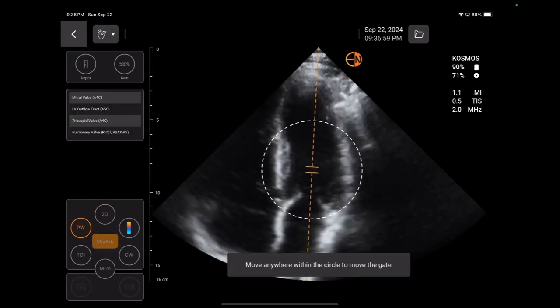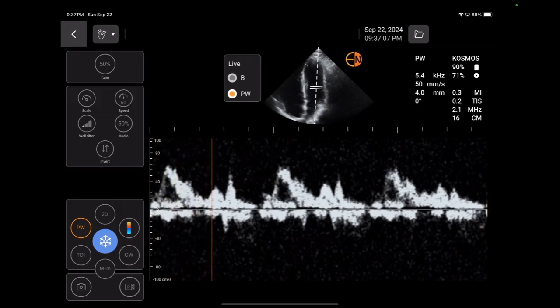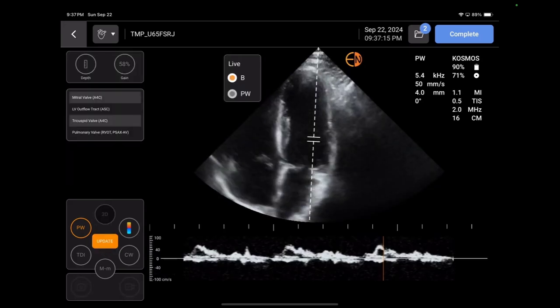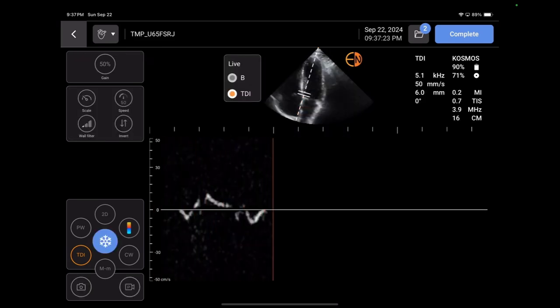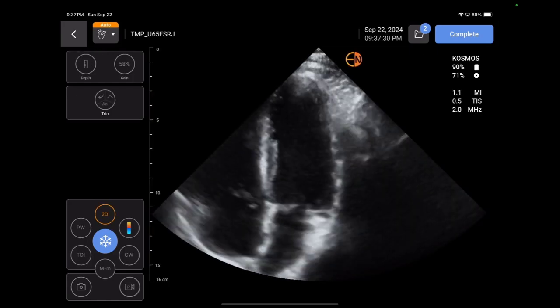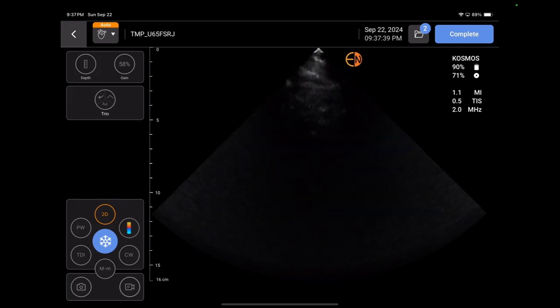For the pulse wave Doppler, if I was going to do a little diastology on myself, I press pulse wave update. I can freeze and save that image — you can see the E wave and the A wave really nicely. I can unfreeze and go back to 2D. If I'm going to do some tissue Doppler, I click the tissue Doppler button, move the gate to where it needs to be, press update, and get a really nice wave. What's really unique about this machine is the ability to do continuous wave and tissue Doppler to really do a full echo.